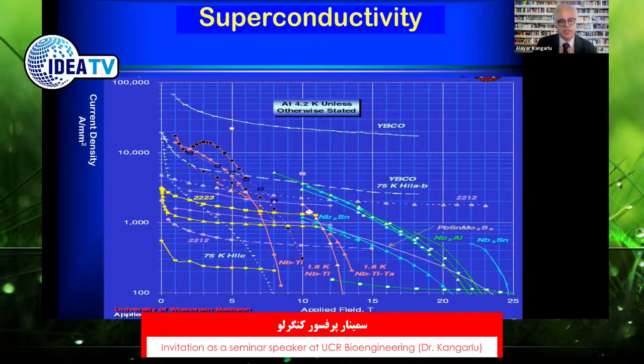And the superconducting material of choice, because of its commercial feasibility, mechanical engineering feasibility, malleability, and so on, is niobium titanium, which provides a very good magnetic field strength up to about 9.4 Tesla. And you can see that beyond 5 Tesla, the current density precipitously drops. And as the current density drops, you have to wrap more and more wire around your cylinder, around your former, in order to generate a strong magnetic field. But we have another solution, which is pumping.